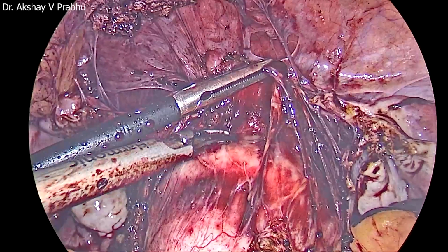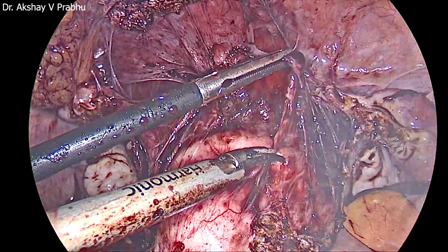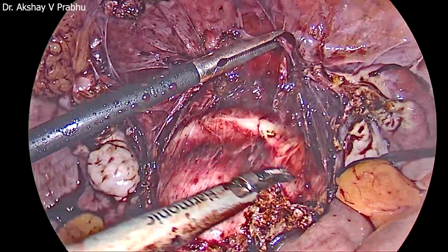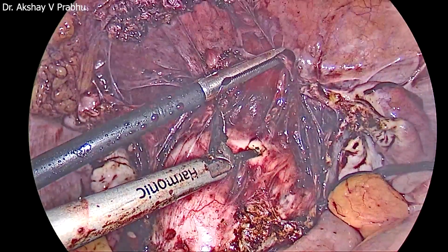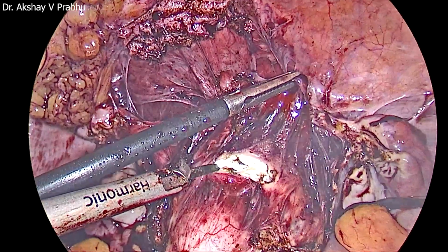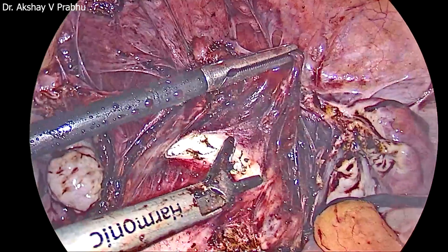Just revising the planes now, you can see the vaginal tube which has been inserted. It's popping up through the fornicial area. So I'm just revising the bladder and pushing it down properly. And then I'll open up the fornix. This is a straightforward simple step followed in all hysterectomies.